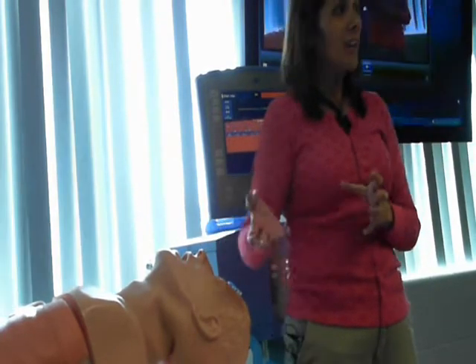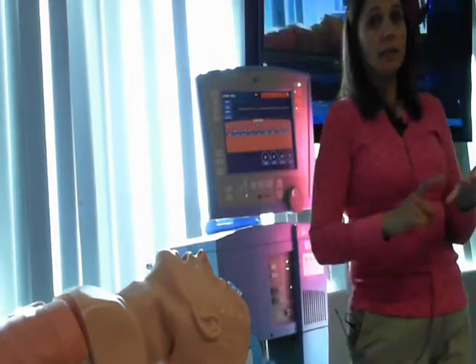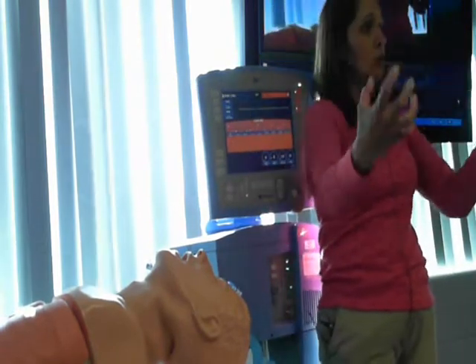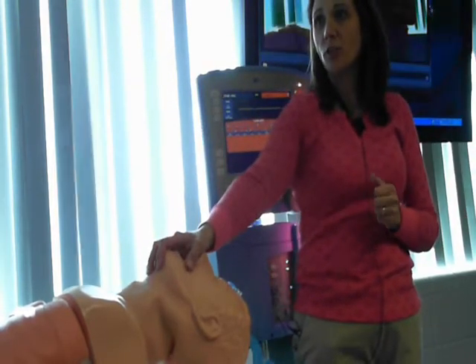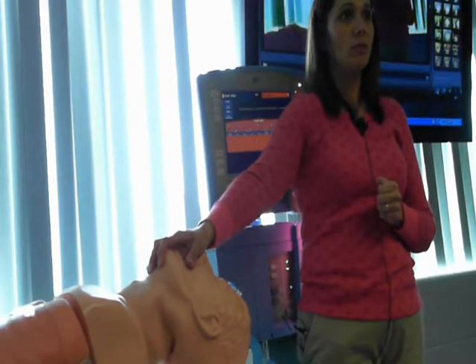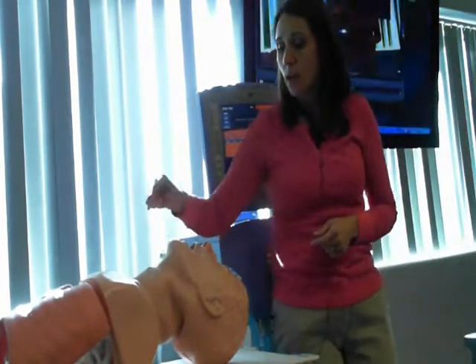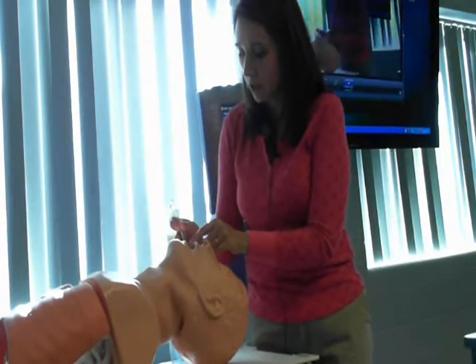Okay. You guys have a lot that you have to keep up with on CCUs. You've got CVPs and Swans and Foley catheters and, you know, all of these other tubes you must keep up with. I ask you to really know where your patient's endotracheal tube is, because long story short, that one comes out and it's going to get real ugly real fast, because not breathing is a bad thing.